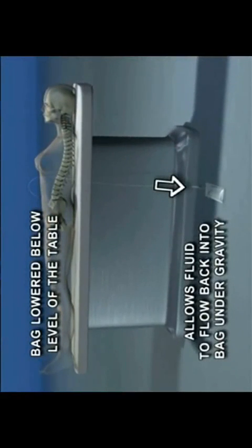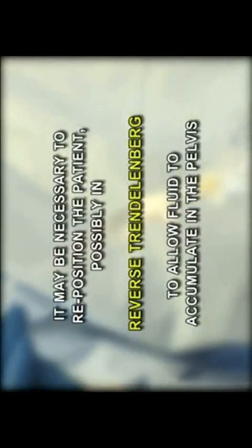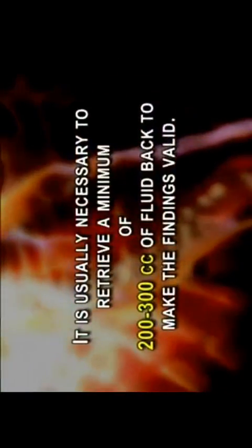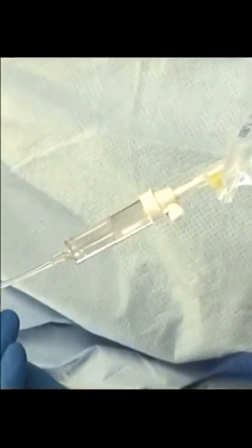gravity. As much fluid as possible is allowed to drain out under gravity, and it may be necessary to reposition the patient, possibly in reverse Trendelenburg, to allow fluid to accumulate in the pelvis. It is usually necessary to retrieve a minimum of 200 to 300 cc's of fluid back to make the findings valid. A sample of this aspirate is then sent for analysis.